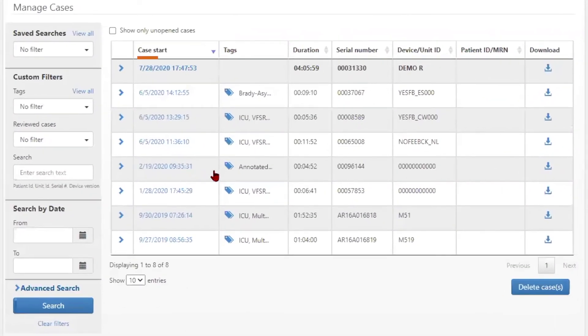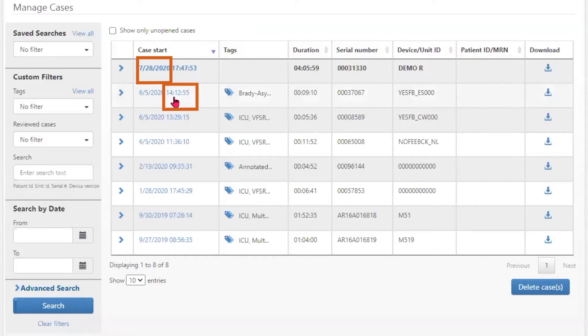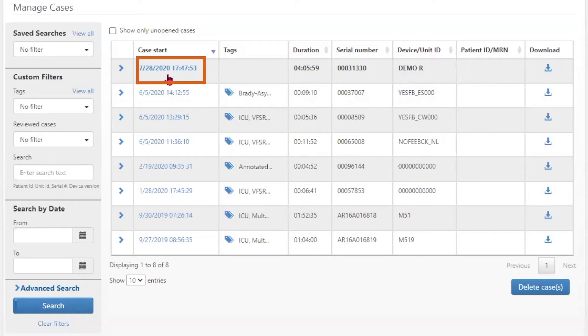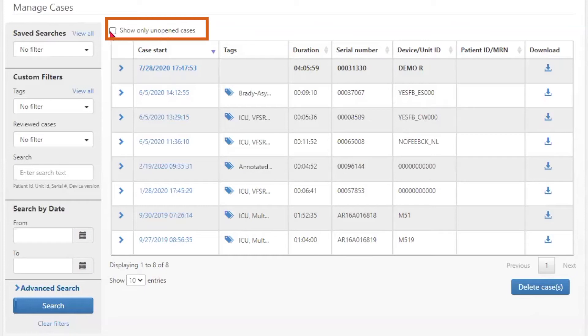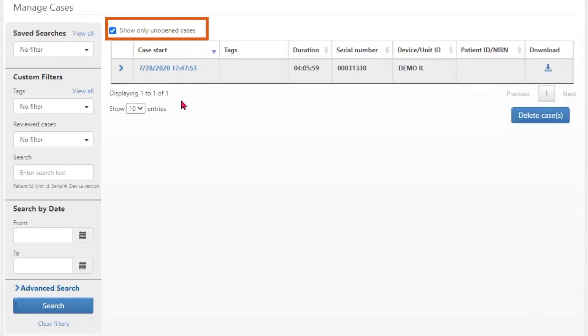Cases are displayed by the date and time that they occurred. Cases in bold are those that have not been opened and viewed. You can view only unopened cases by selecting show only unopened cases in the box at the top of the page.